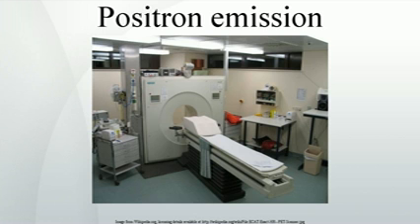Safety. PET scanning is non-invasive, but it does involve exposure to ionizing radiation. 18F-FDG, which is now the standard radiotracer used for PET neuroimaging and cancer patient management, has an effective radiation dose of 14 mSv. The amount of radiation in 18F-FDG is similar to the effective dose of spending 1 year in Denver, Colorado, 12.4 mSv per year.